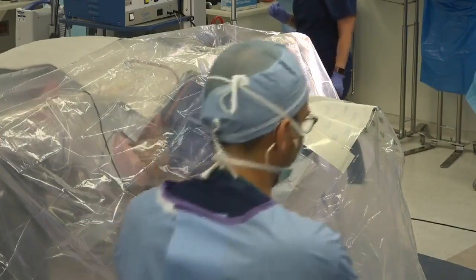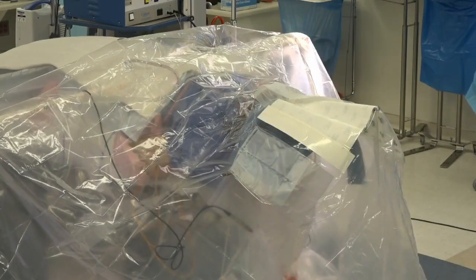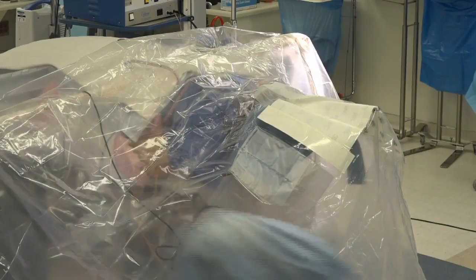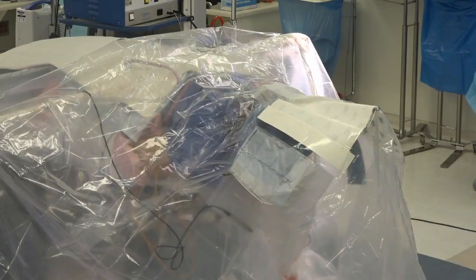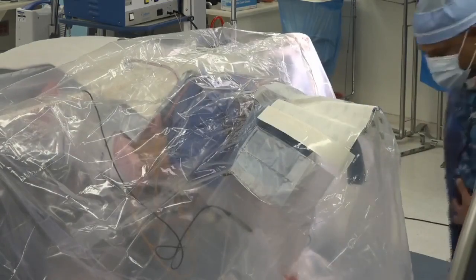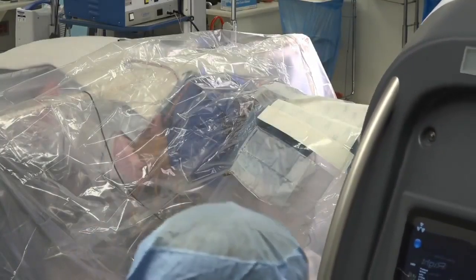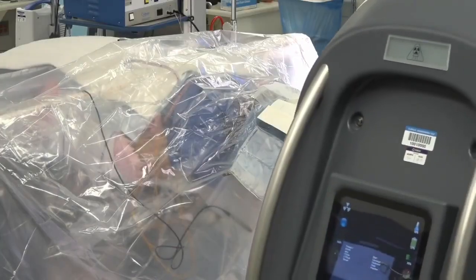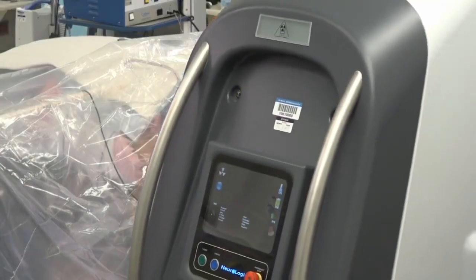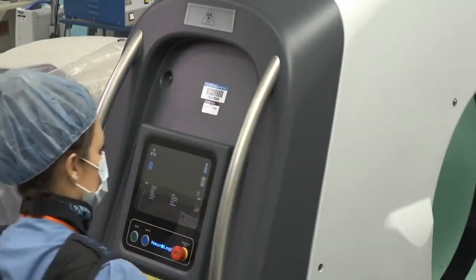Okay, so what we're going to do now is we're getting our intraoperative CT scan. So the patient's all draped, the lead has been placed. Yeah, we're ready. And we did not move the bed at all, so we should be good.